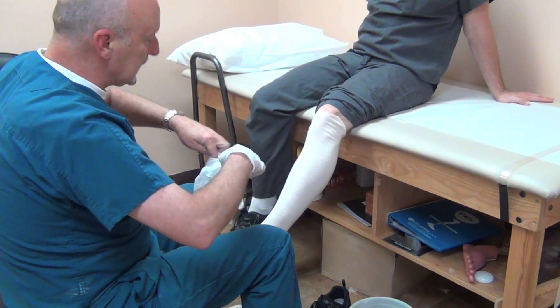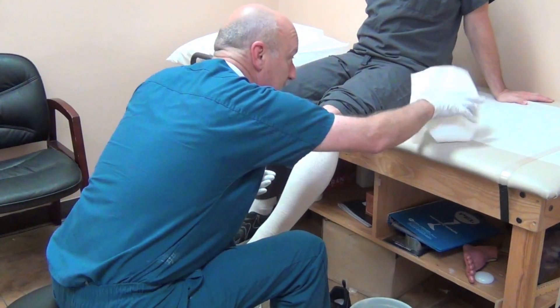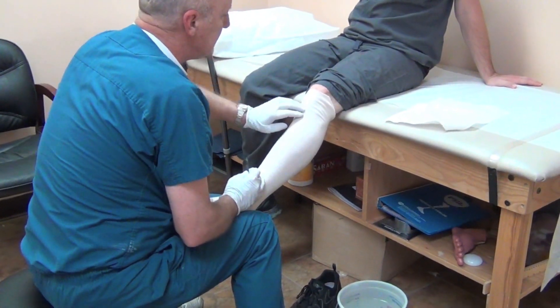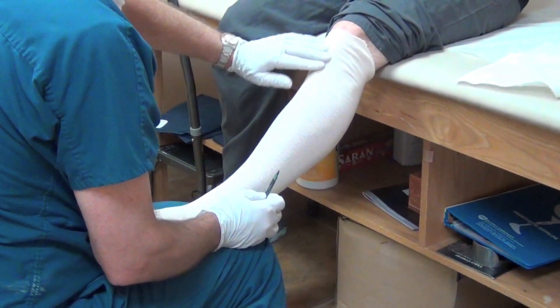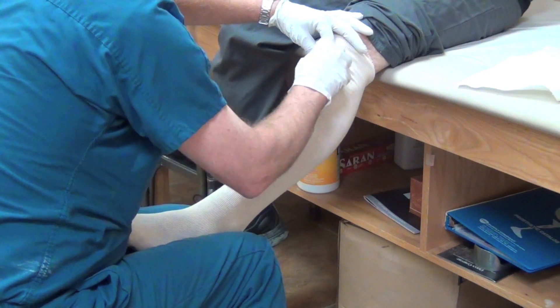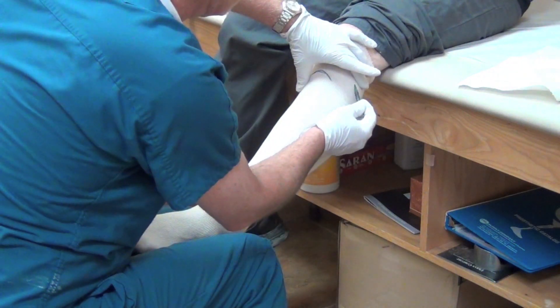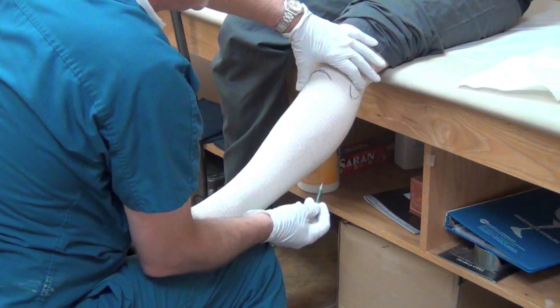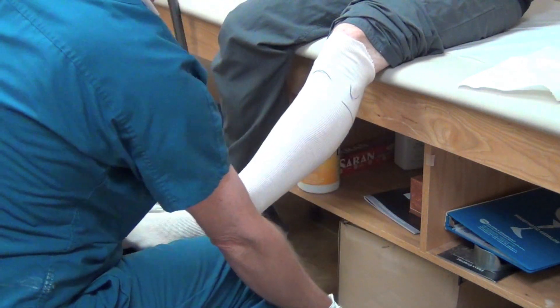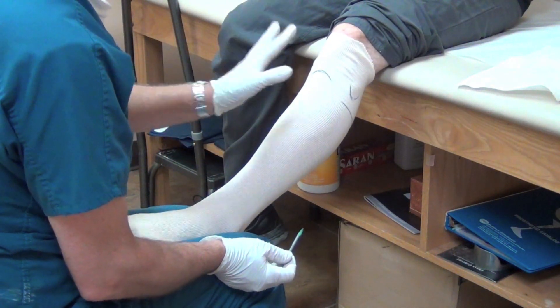What I'm going to demonstrate here is really for any AFO, but I'm going to give marks for the Turbo because the Turbo is by far the most popular brace we make. For a Turbo, I need the anterior tibial tubercle marked. On him it's not prominent, so I just mark the insertion point of the patellar tendon — just an upside-down smile so I know where I want it to end. For all other AFOs, you really just need to mark the fibular head, or if you want to mark the trim line at the fibular head, do a semicircle trim line. These marks are all important and really the only marks that I need.